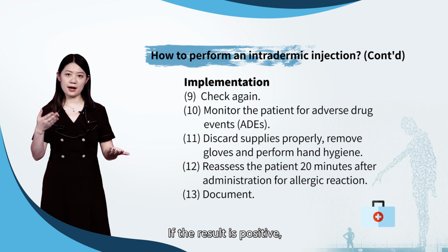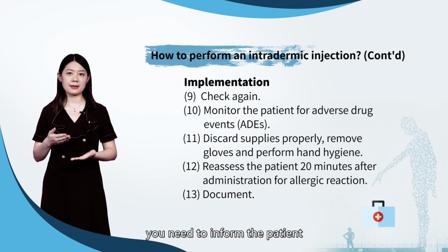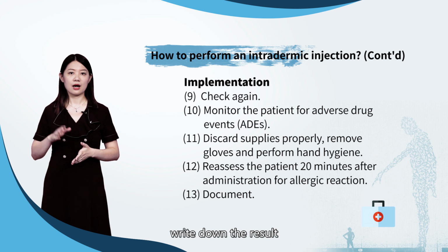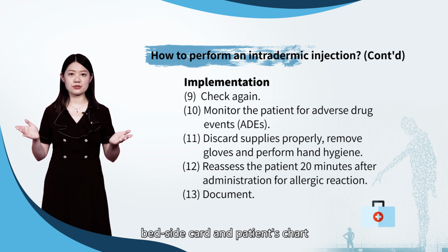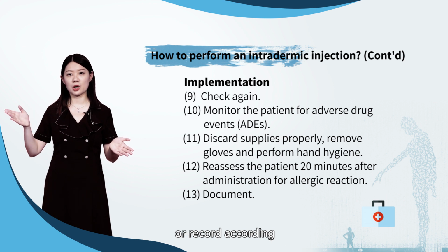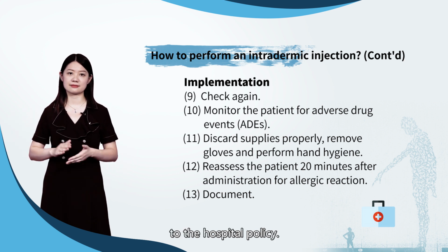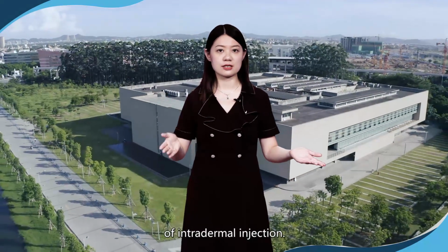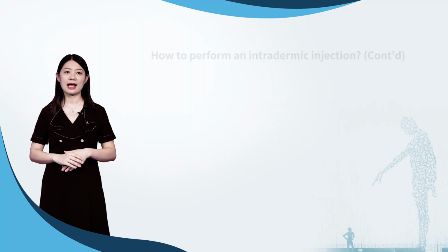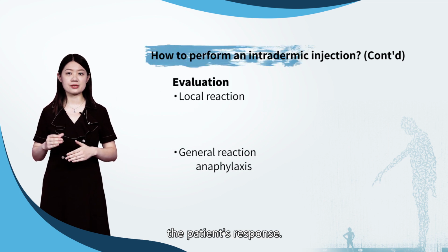If the result is positive, you need to inform the patient and his doctor. Write down the result on the wristband, bedside card, and patient's chart or record according to the hospital policy. So far, we went through each step of intradermal injection. Then we'll evaluate the patient's response.